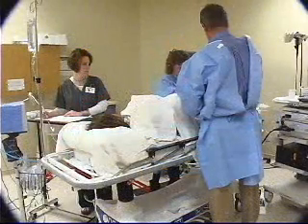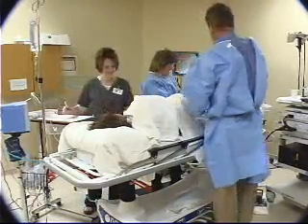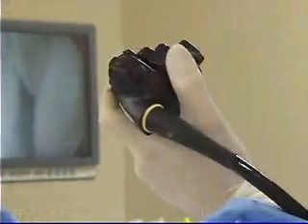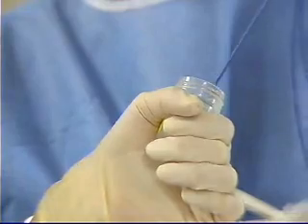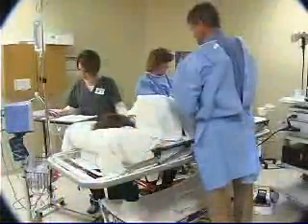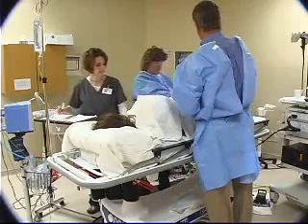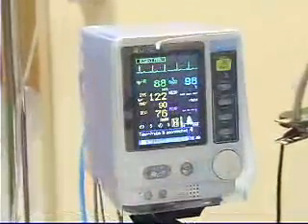After you are comfortable, the physician will perform the procedure. Your procedure will take an average of 30 to 45 minutes. During the procedure, the physician may take biopsies, remove polyps, or perform treatment. A report will be sent to the physician from pathology if any specimens are sent out for testing. Your physician's office will give you the results. Your procedure may be stopped if you are having a colonoscopy and the colon is not cleaned out, or if you are unable to tolerate the procedure.